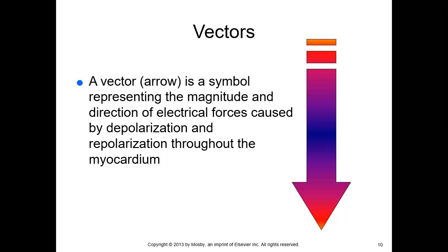Leads that face the tip or the point of the vector record a positive deflection on the paper, the ECG paper. So I'll repeat that. The leads that face the tip or point of the vector record a positive deflection on the paper.